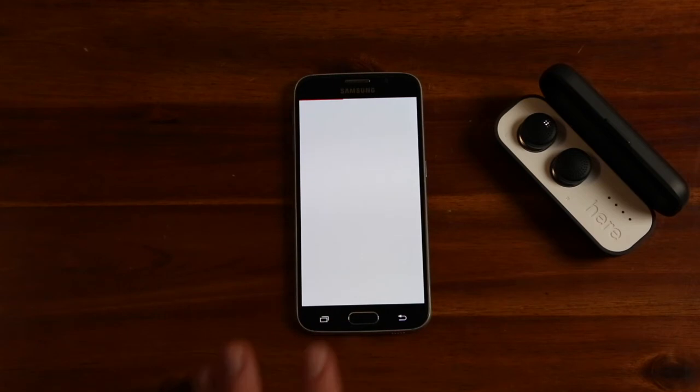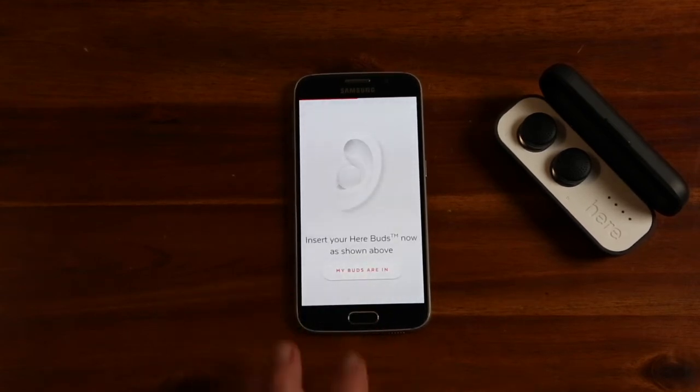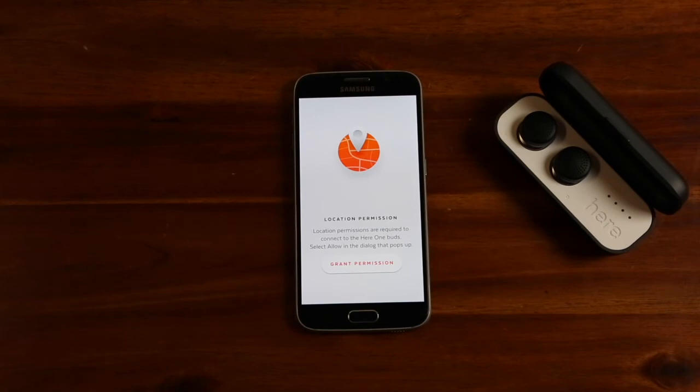If you haven't already done so, take a look at the tips included to find the best fit. Then take the buds out and fit them comfortably in your ears. You will need to give the app location permission in order to pair the earbuds.